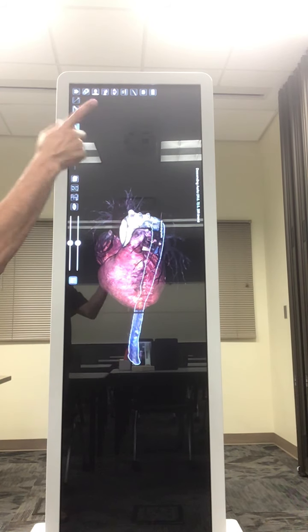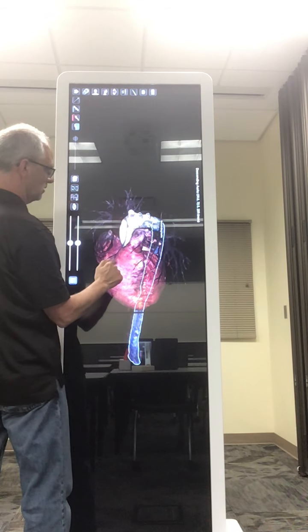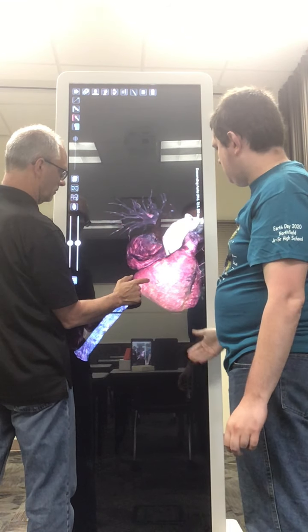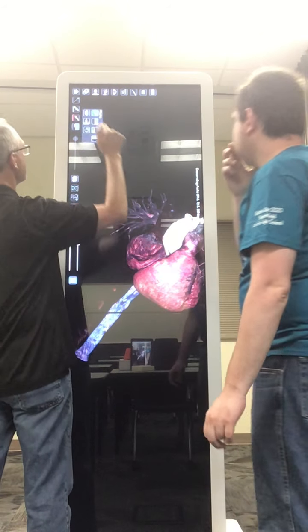And we need to look at, dissect the heart. Open it up. Let's look at the inside of the heart. Okay, which way do you want to cut it? Let's cut it so that you can see. Okay, let's cut it, I know what to do. Cut it this way.